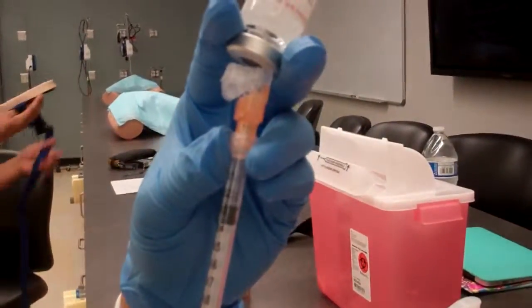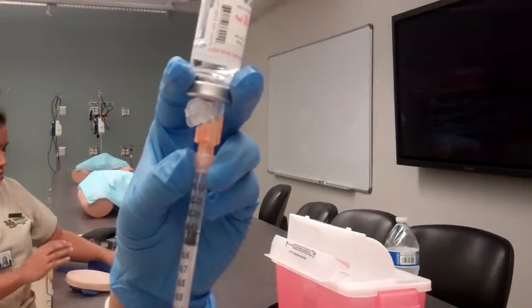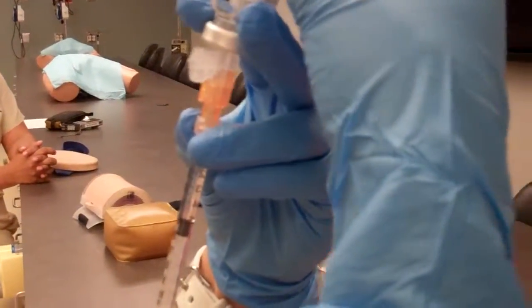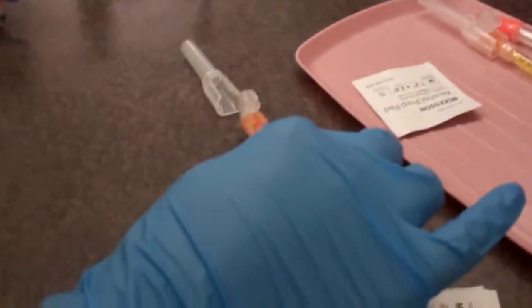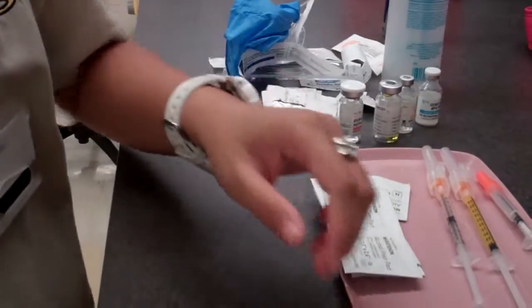Inject the air. Okay, so I'm going to have another nurse check what this medication is. Okay, that's heparin. And it's half, 0.5. Okay. 0.5. Thank you. I'm going to withdraw my needle. I'm going to make sure my cap is stabilized, and then cap it. Okay. I'm going to get my wipes. And now I'm going to go see my patient.